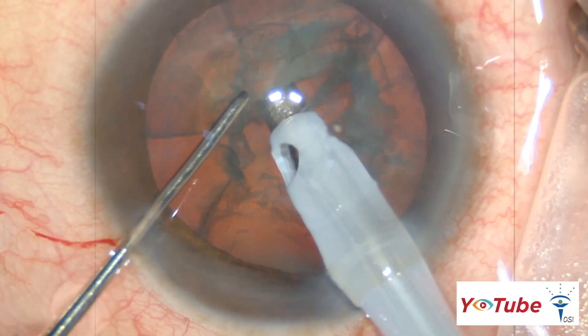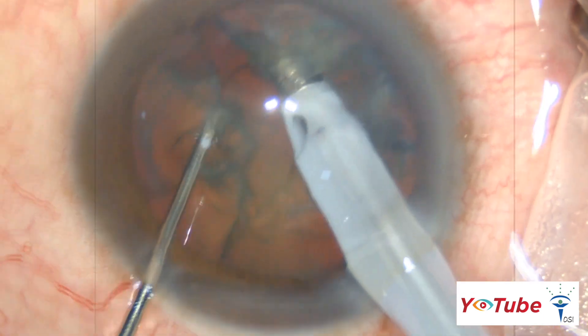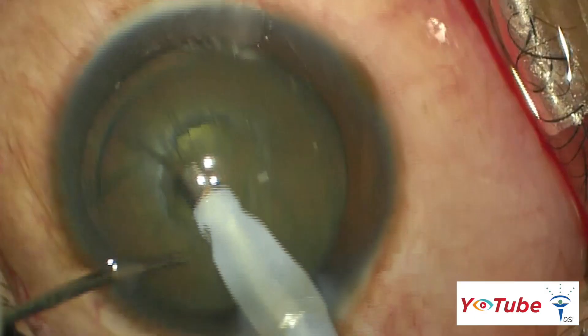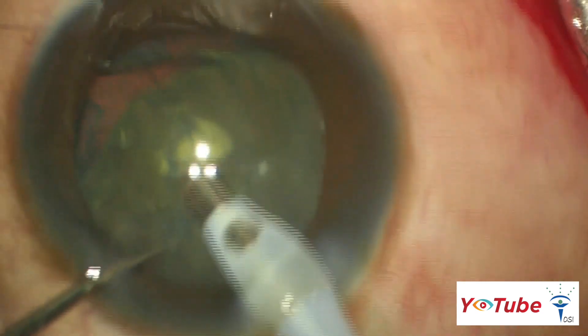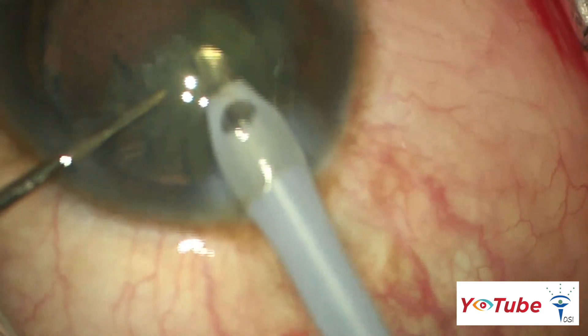For harder cataracts, a step-by-step chop in-situ and lateral separation technique can be used. Slow-motion phacoemulsification with low aspiration, low infusion, and low vacuum parameters are preferred. The low vacuum and aspiration rate maintain a stable anterior chamber, and the low infusion drives less fluid around the lens.